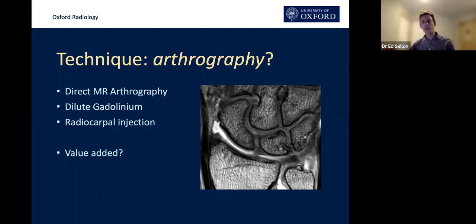The reason for injecting a single compartment is that you can exert greater tensile pressure within it, which exposes weaknesses in the wall more effectively. If you're trying to exploit a tiny perforation in the TFCC or the scapholunate ligament, you want to pump as much contrast as possible into just one compartment. This reduces the high false-negative rate you get with multi-compartment injections. We're now moving to doing these under ultrasound guidance, though the number of requests seems to reduce by the month.